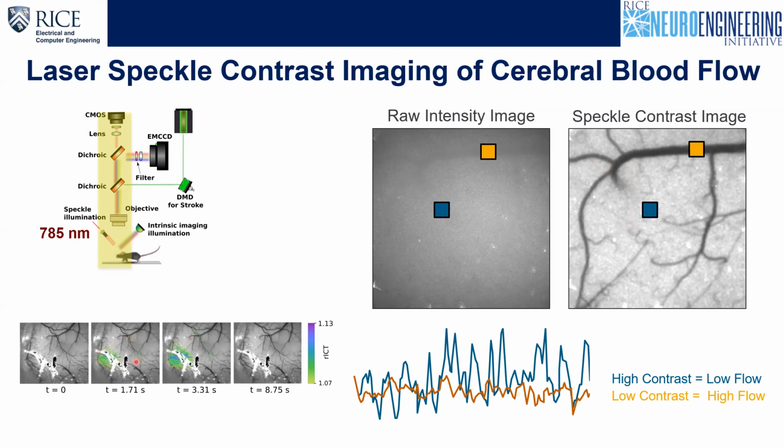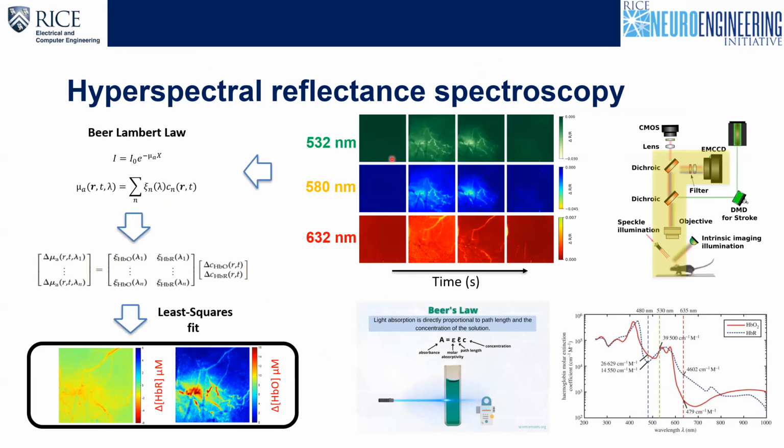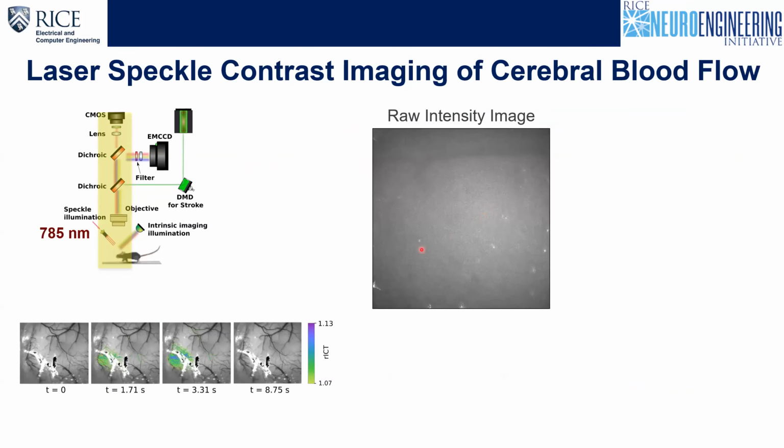This image on the bottom left is exactly the same brain that I showed earlier for the reflectance spectroscopy, as a function of time. So here we show t equal to 0 to t equal to 8 or 9 seconds, and then we expose the brain to some stimulation.